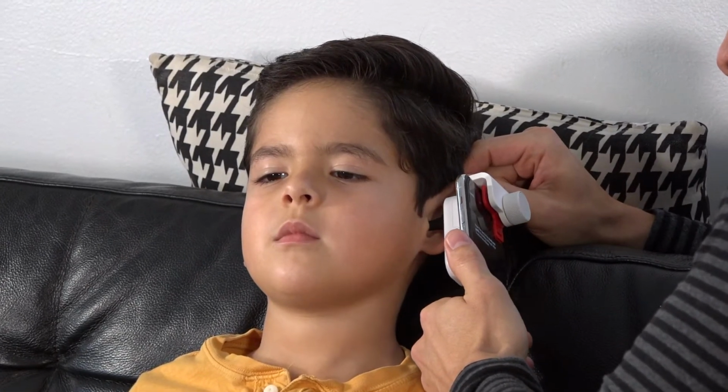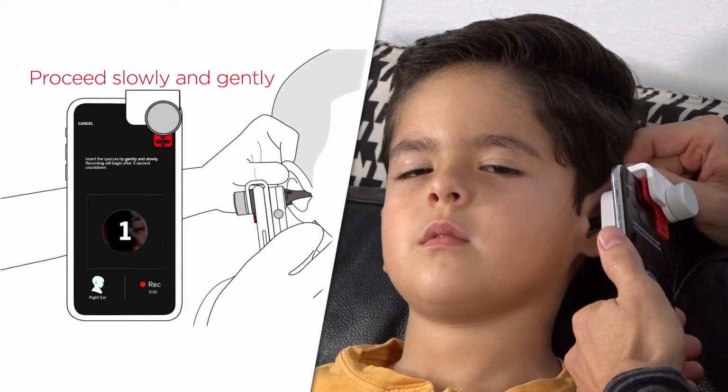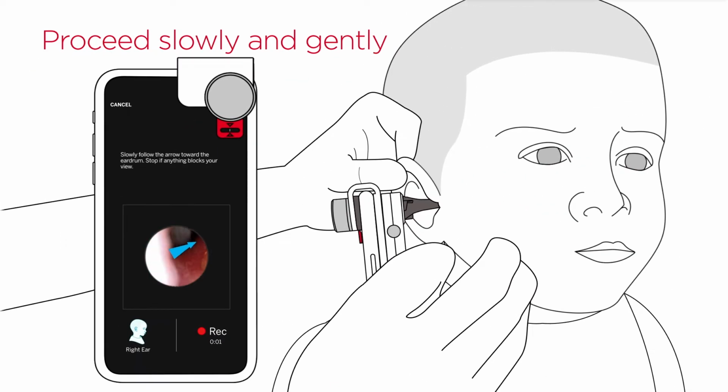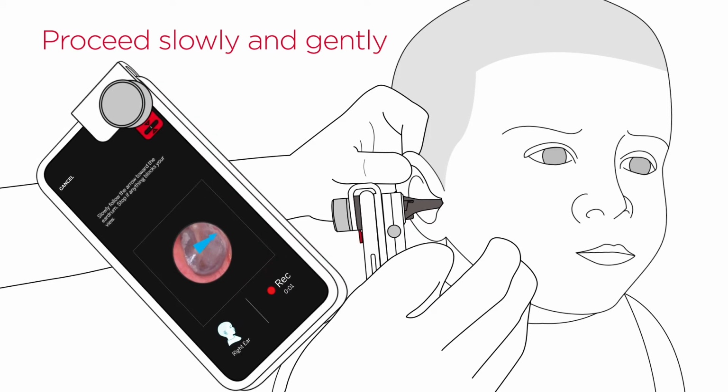It should look like you're going down a small tunnel, and you may need to angle the specula tip slightly towards your child's nose to follow the natural curve of the ear canal. The eardrum finder arrow will help guide you. And it's okay to tilt your child's head away from their shoulder or even rotate your phone slightly.